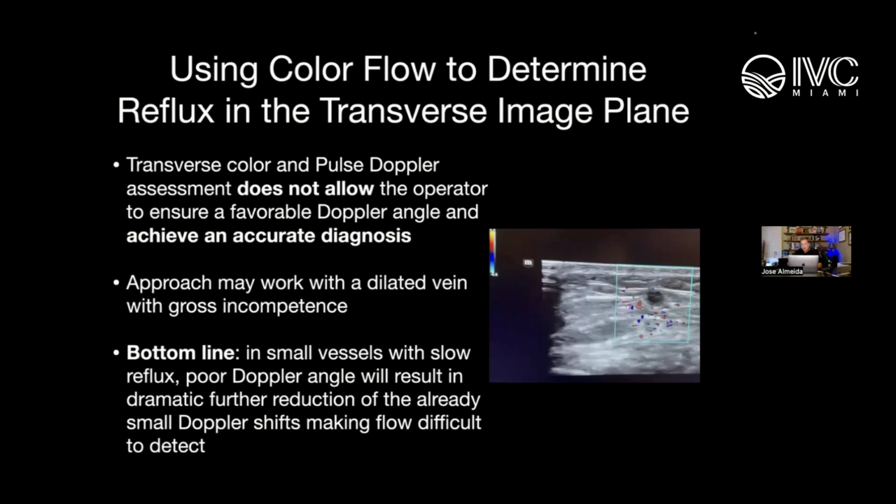Yeah. If you're the one doing the exam and documenting, you have to do it all correctly by the book to get accuracy. But for us, I've usually got an ultrasound exam in front of me and I'm just kind of mapping up and down to see what device I want to use based on the characteristics of the vein.